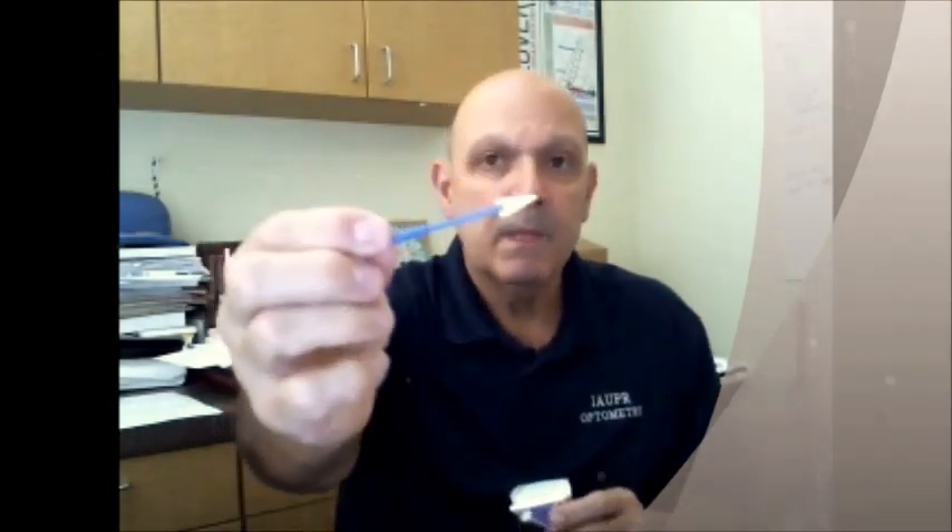Number one, you need anesthetic. You can use proparacaine or tetracaine. Number two, you're going to need surgical spears. These are extremely absorbent.